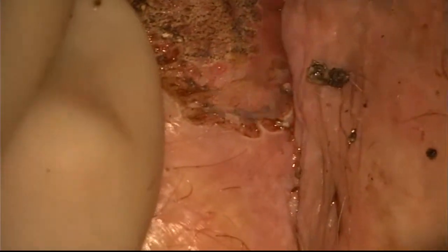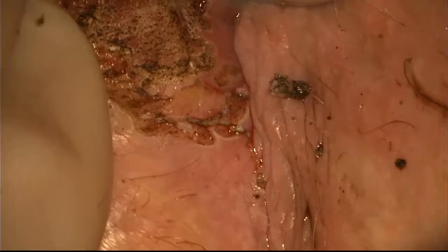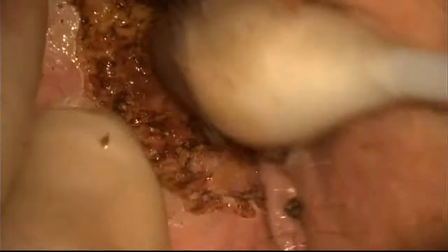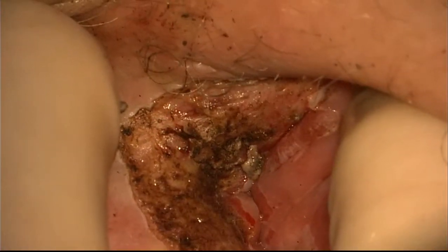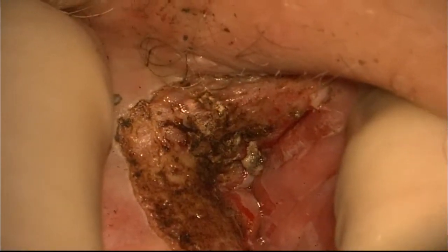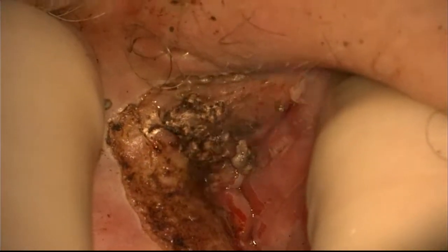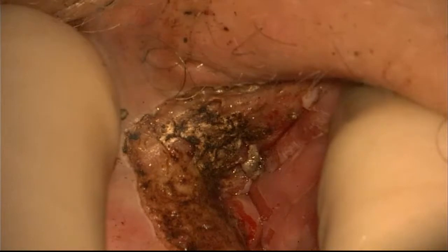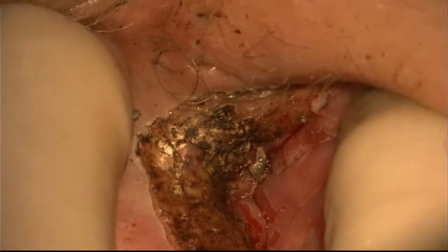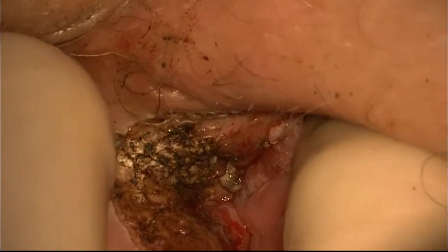By preserving some of the underlying dermis, the epidermis will migrate faster, heal faster, and there will be less pain for the patient. There will be discomfort for the first seven to ten days. Some topical lidocaine may help, as well as some silvadene cream.